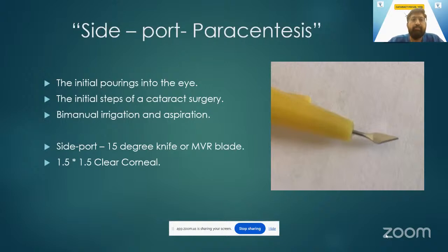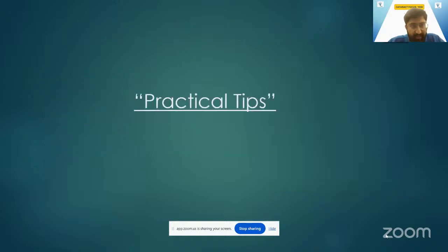My presentation will mainly encompass phaco, and in the discussions I would cover some SICS explanations as well. A practical tip I realized is that beginners, as any resident or young ophthalmologist setting out in cataract surgery, get the side port first.